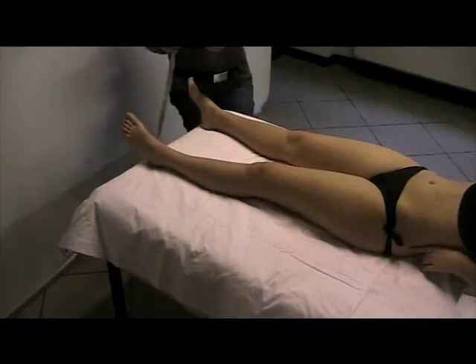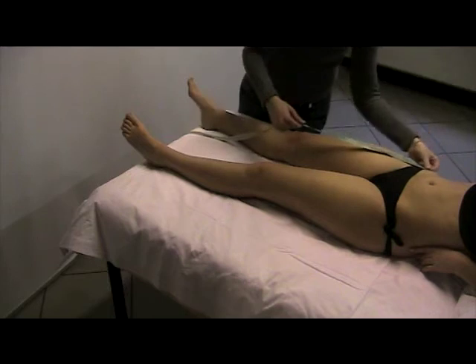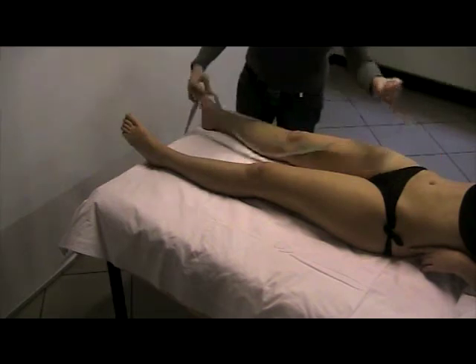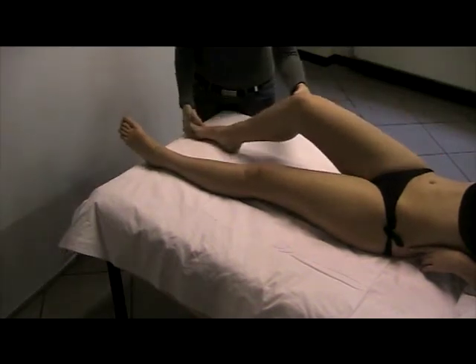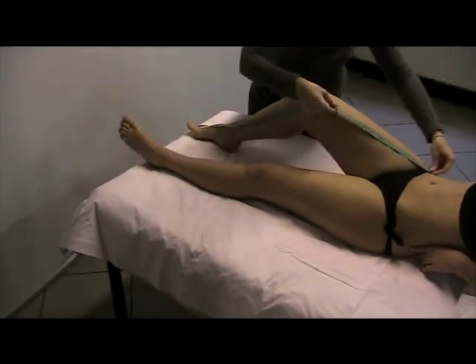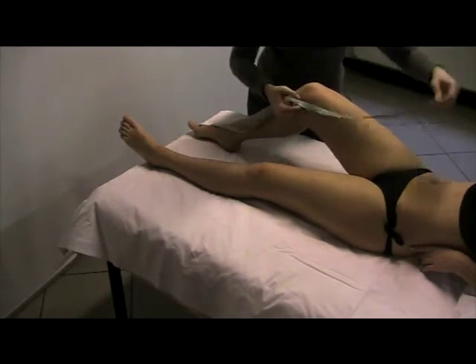Finally, let's go to measure the total leg length with the meter, from the iliac spine to the medial malleolus through the knee. In case the patient has the knee blocked in flexion, the measure has to be split: from the iliac spine to the medial femoral epicondyle, and from this point to the medial malleolus.